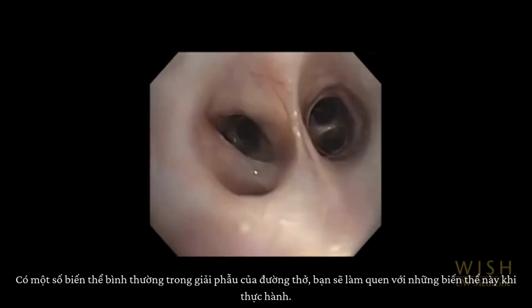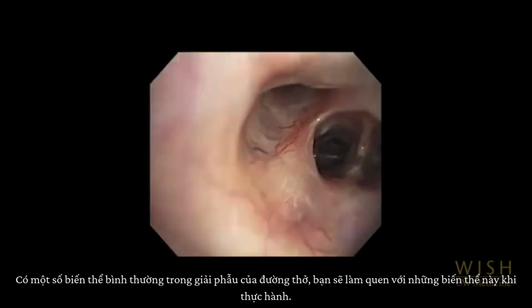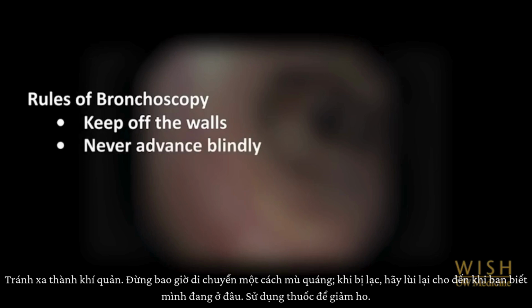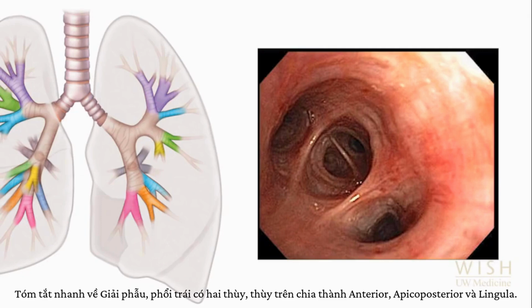There are a number of normal variations in the anatomy of the airways. You will become familiar with these as you practice. In this presentation, we have demonstrated the most common airway anatomy and illustrated the rules of bronchoscopy. Keep off the walls, never advance blindly. When lost, pull back until the point that you recognize. Use medications to reduce cough. Now for a quick anatomy reminder.